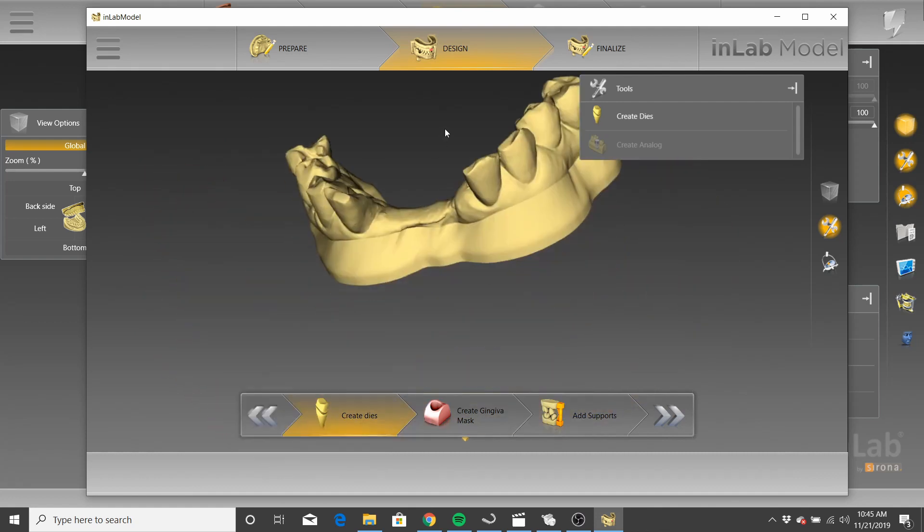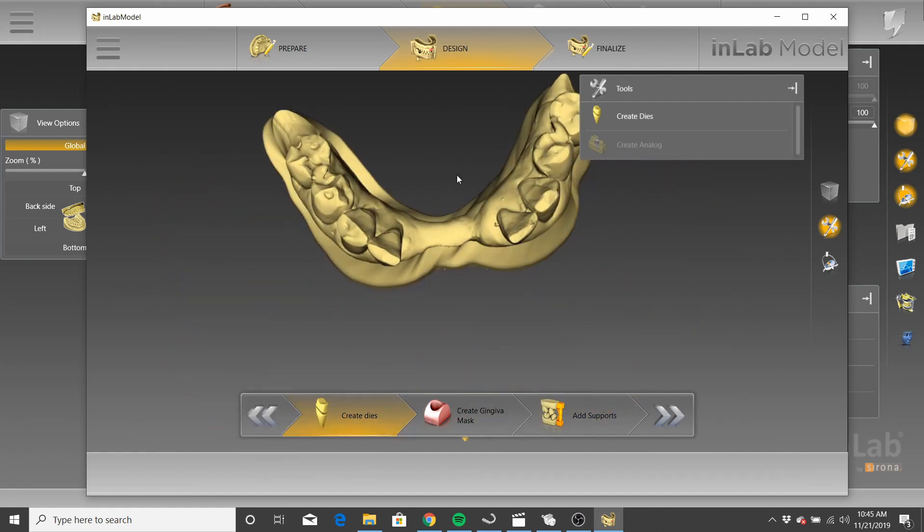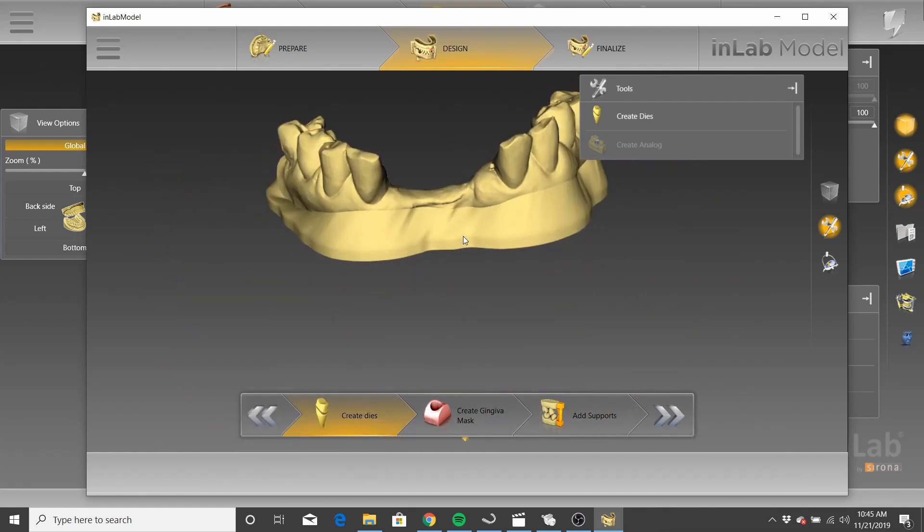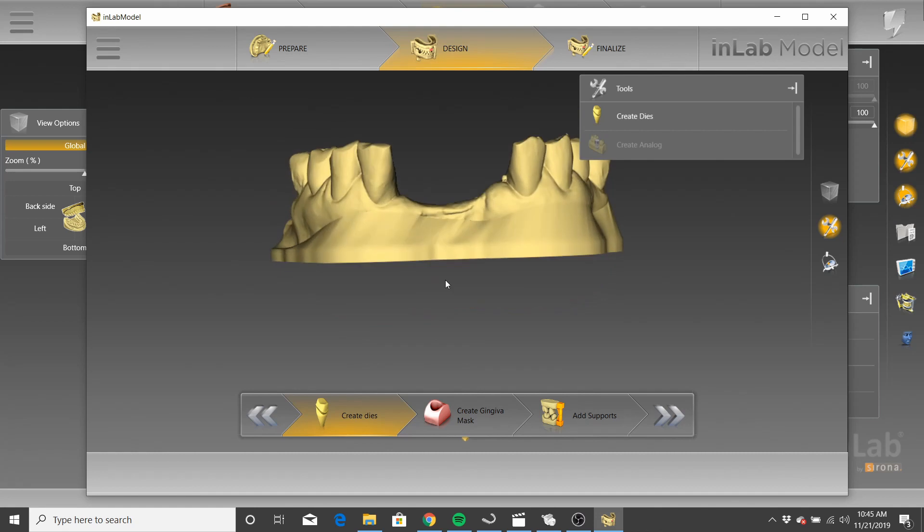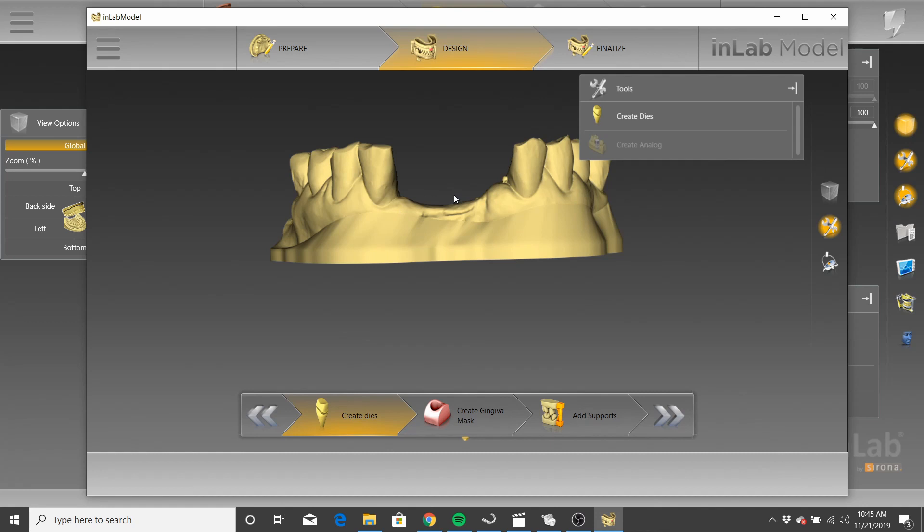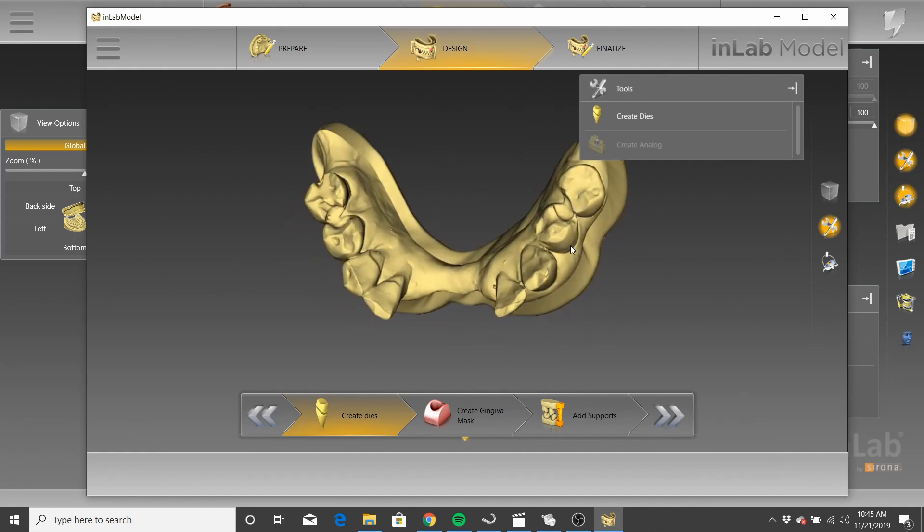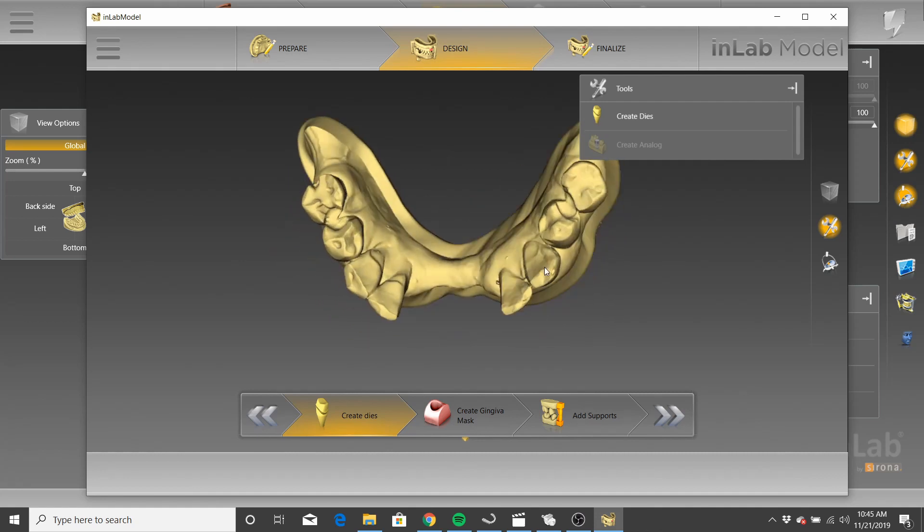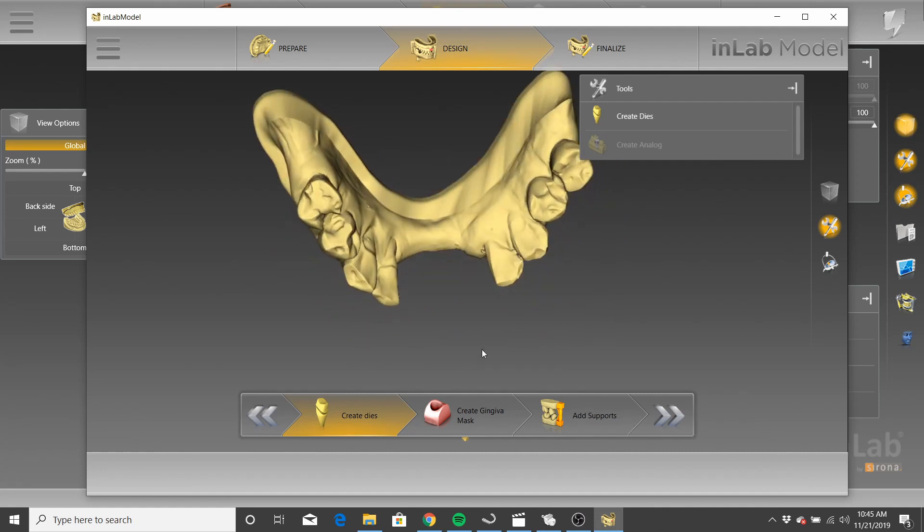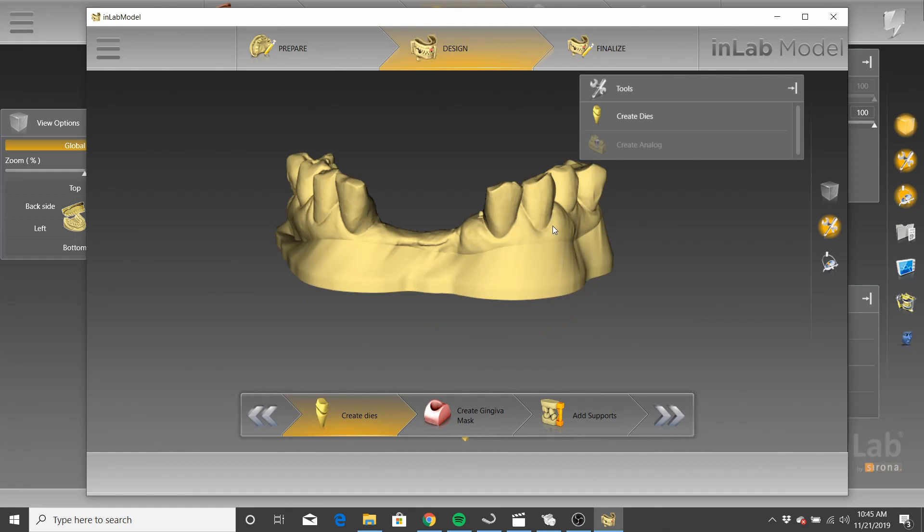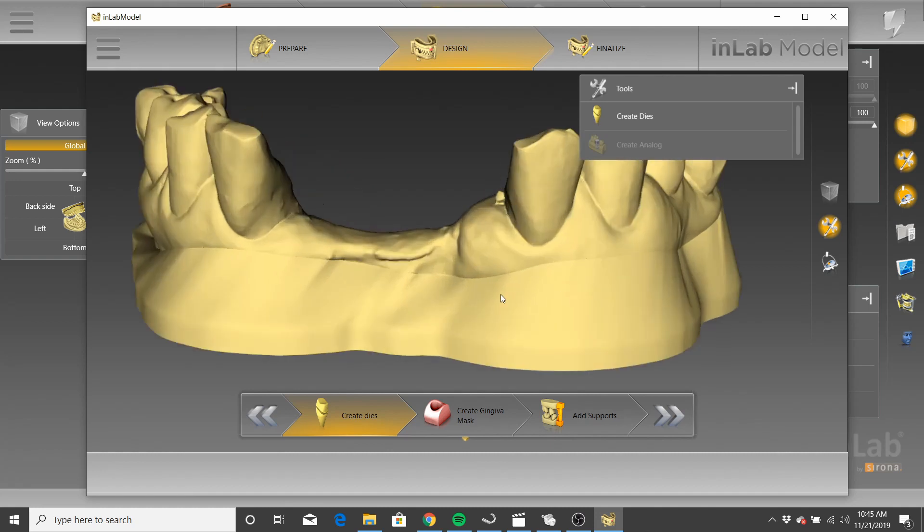What's happening is when you virtually seat a bridge, you're creating two STL files. One is for the bridge and each individual pontic, and then one is for the scan. Now, when you call your wax-up crowns, when you virtually seat those, it's just going to create one STL file. Where with a bridge, it's creating multiple STL files. And the only STL file that the in-lab model module is going to recognize is the jaws scan.